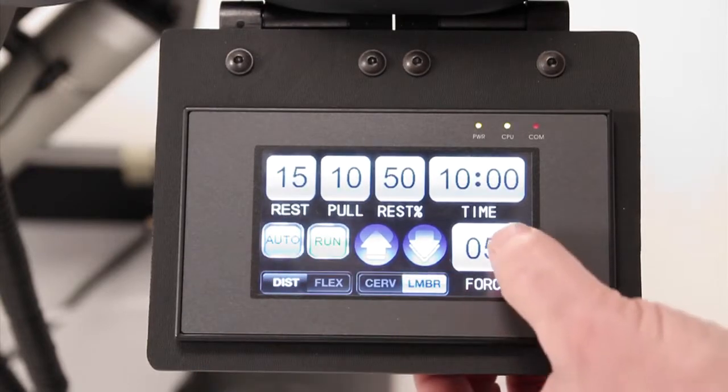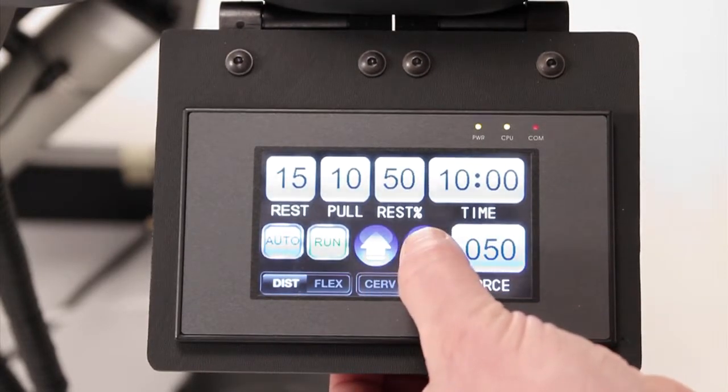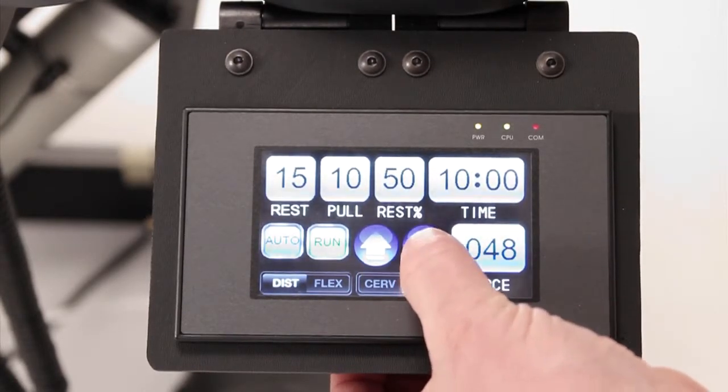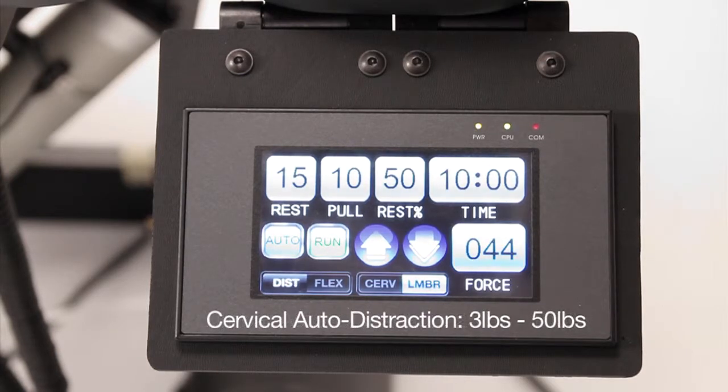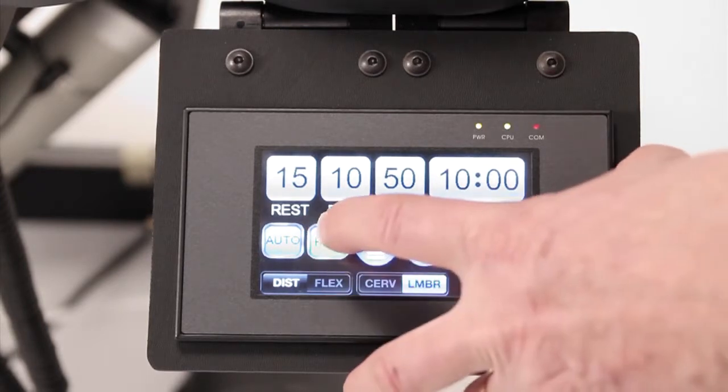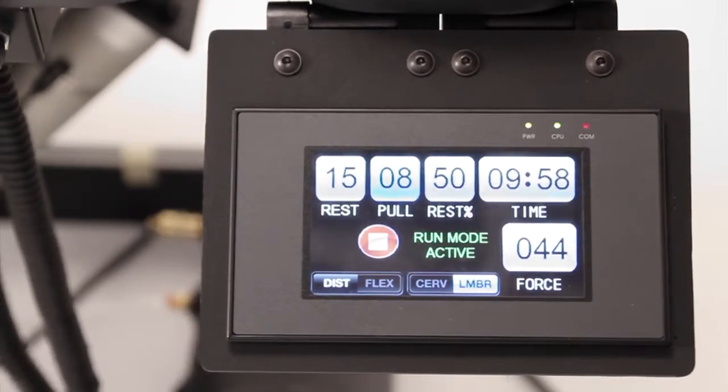Tap the manual button to switch to automatic mode and set the force setting. The treatment force is measured in US pounds. It is programmable from 25 pounds to 100 pounds for a lumbar treatment and 3 pounds to 50 pounds for a cervical treatment. When all desired settings are entered, touch the green Run button to start the treatment.